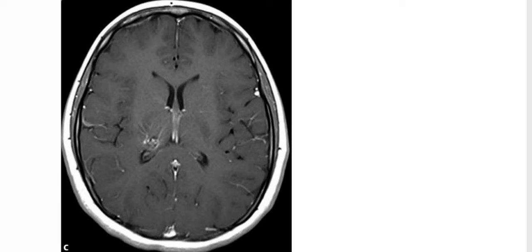This is the axial T1 post-contrast sequence, and it is showing that there is mild enhancement within this lesion, as well as portions of the adjacent developmental venous anomaly that are enhancing. So the portions of an adjacent developmental venous anomaly are also noted here, along with this lesion, which is enhancing.